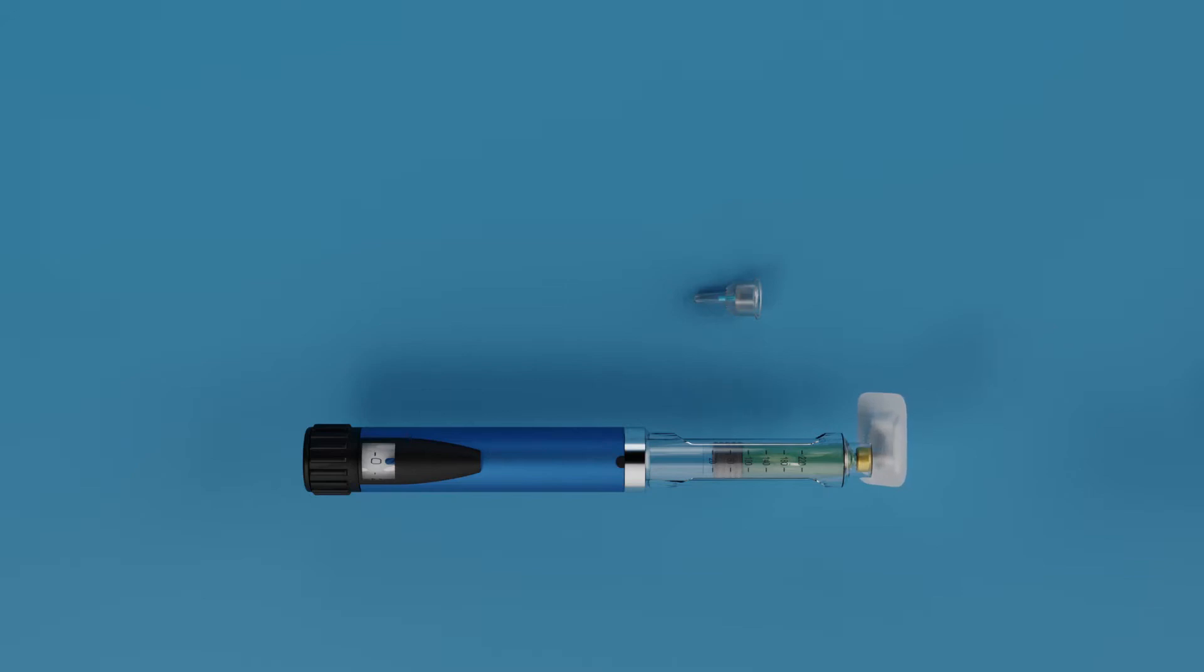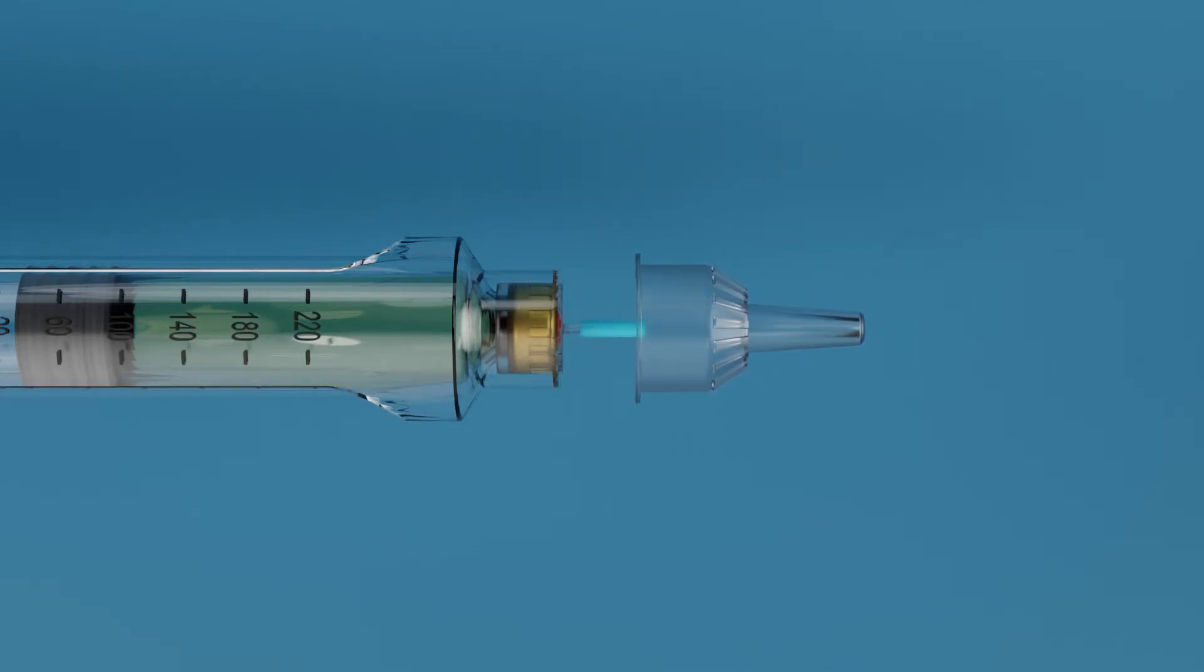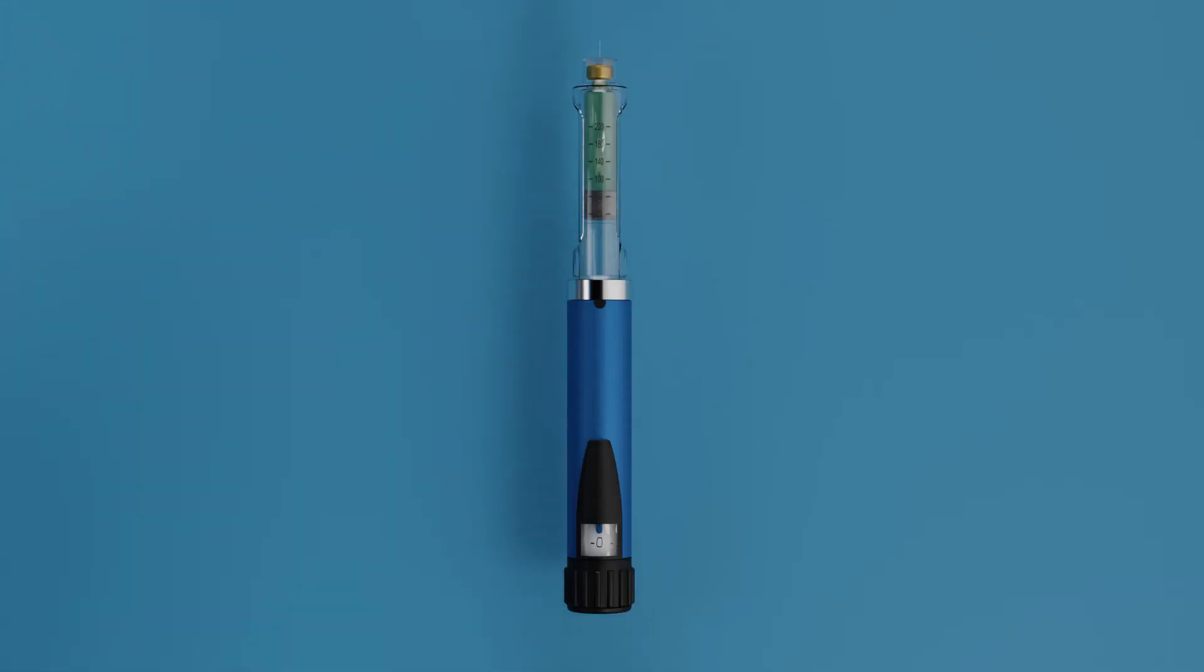Take the needle, remove the safety cap, and attach it firmly on top of the pen by screwing it until it is firmly locked into place. Remove the outer protective cap and the needle cap from the needle. Never touch the needle.